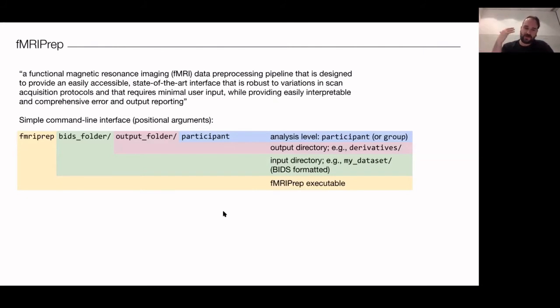And this will depend on the kind of BIDS app that you're using. In the context of fMRIPrep, you're typically going to be doing a participant level, within subjects analysis. MRIQC is actually a little bit different, right? Typically you want to run MRIQC on each of your subjects at the participant level. And then after you've done that, you can run MRIQC again, specifying group, which will aggregate across all of those individual subject runs of MRIQC and give you that group plot like the ones that I showed you. So this looks relatively simple, but it does get a little more complicated when we take into account Singularity and things like this for running on a server.